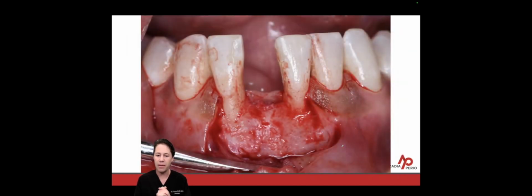So, full thickness flap design, and look at how amazing that bone looks from where we started. Remember the giant defect that was right in this area here, as highlighted by the red pen on the photograph? I mean, this is as perfect as it can be. Look at that tissue thickness that we have here and here from that incorporated microderm. This can be super easy to suture to.